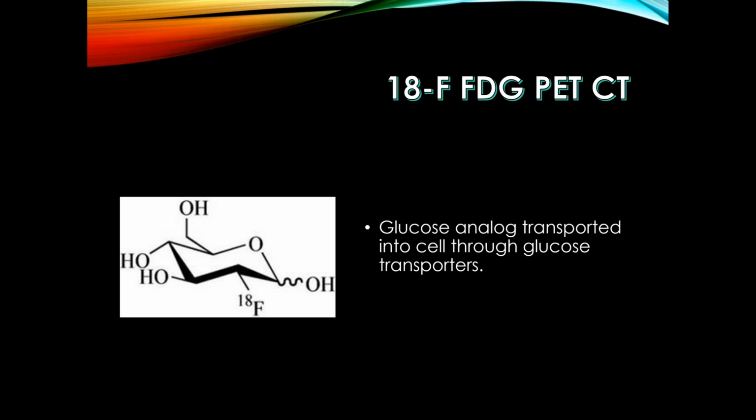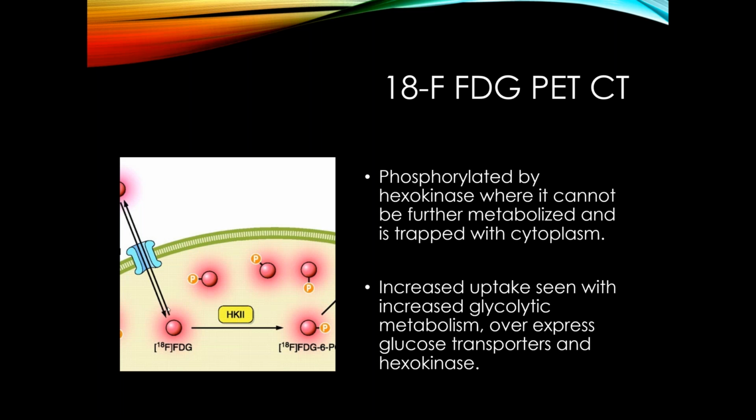But it's starting to be used with neuroendocrine tumor imaging, and I'll explain how it works. This is FDG. So we label FDG to a radioactive positron emitting fluorine 18. The FDG is basically a glucose analog. So it behaves just like sugar that we have in our bodies, except we removed the hydroxy group with F18. And it basically gets taken up by cells and it accumulates there so we can image.